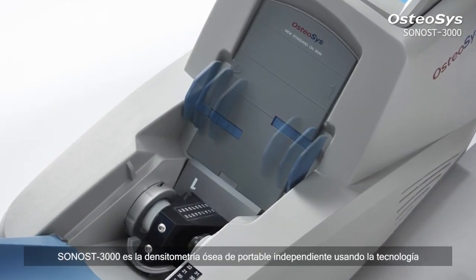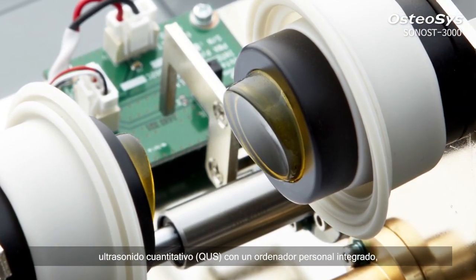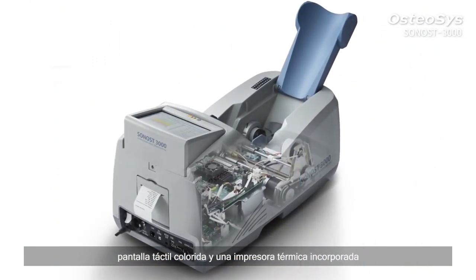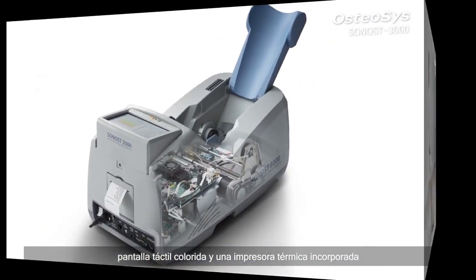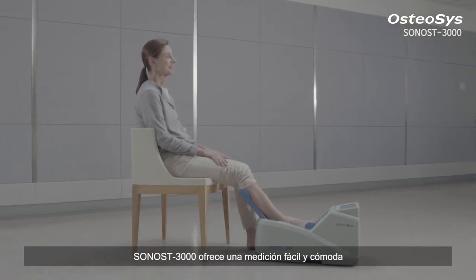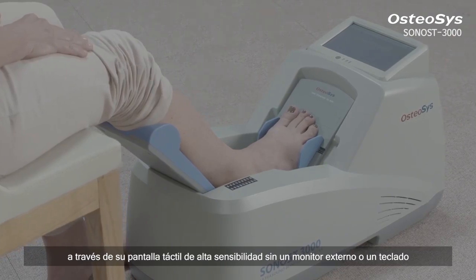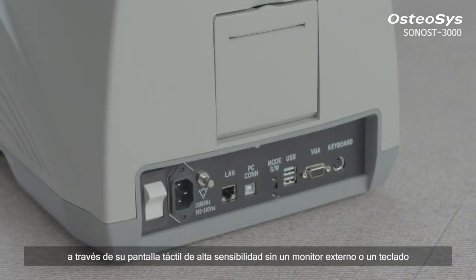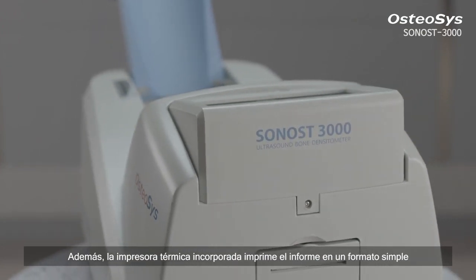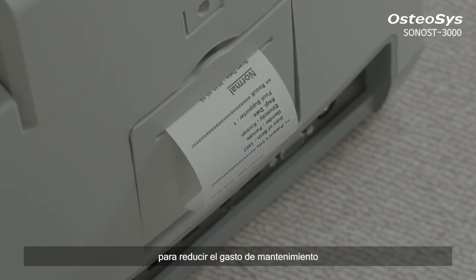Sonos 3000 is a portable stand-alone quantitative ultrasound bone densitometer with an embedded PC, colorful touchscreen, and a built-in thermal printer. Sonos 3000 offers a comfortable and easy-to-handle measurement through its high-sensitive touchscreen without an external monitor or a keyboard. Moreover, the built-in thermal printer prints out report cards in a simple format to cut down maintenance cost.